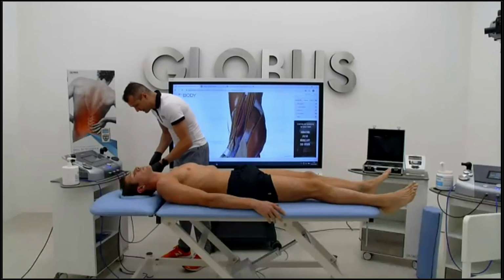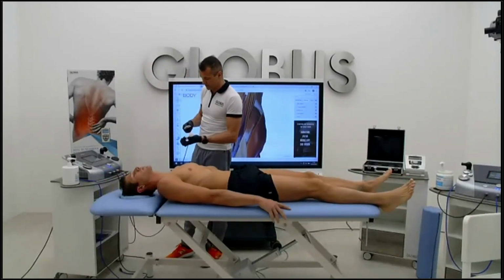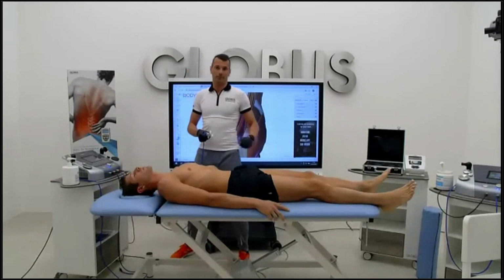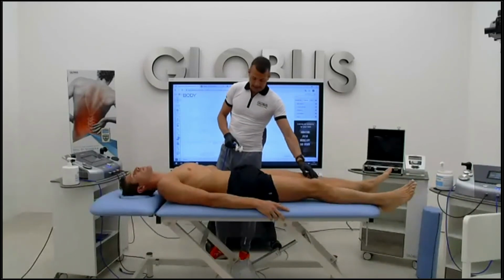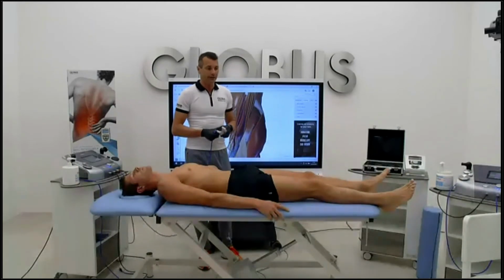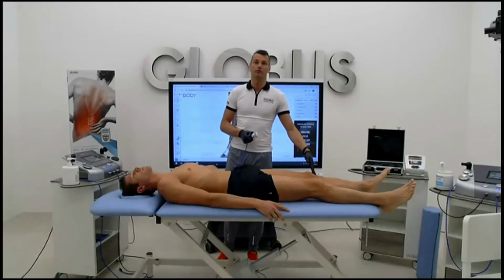All right, let's talk about other things like chronic tendinopathies, for example. On the lower limb, the very common chronic tendinopathies could affect the patellar tendon or the rectus femoris tendon. As I told you before, if we have an acute injury, don't do the treatment with the fascia tool directly over the tendon.